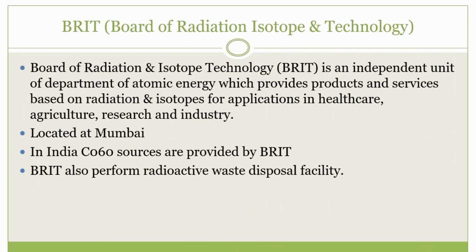Another organization is BRIT, the Board of Radiation and Isotope Technology. I said that in radiotherapy there is a telecobalt machine which uses a cobalt source, a radioactive source having a half-life of 5.26 years. A cobalt source of 10,000 curies, such a high amount of activity, has to be loaded into this cobalt machine, which is quite dangerous from a safety point of view, and was previously imported from other countries. But now in India, BRIT is able to produce such high activity sources for applications in medicine.